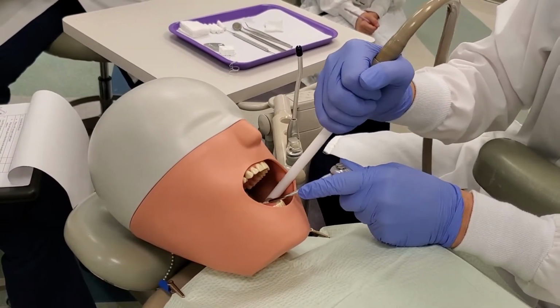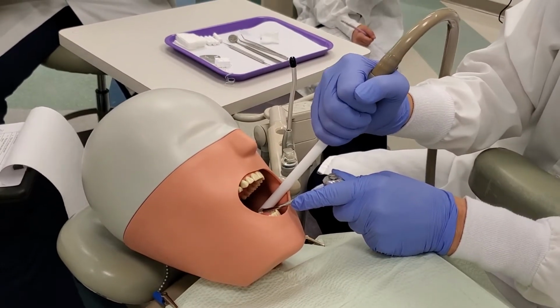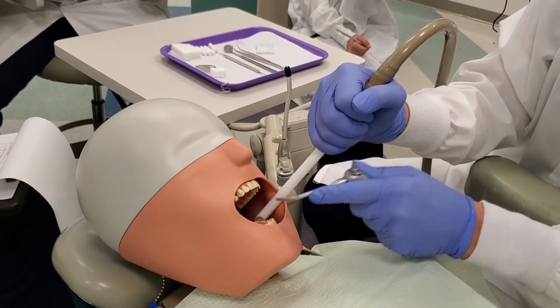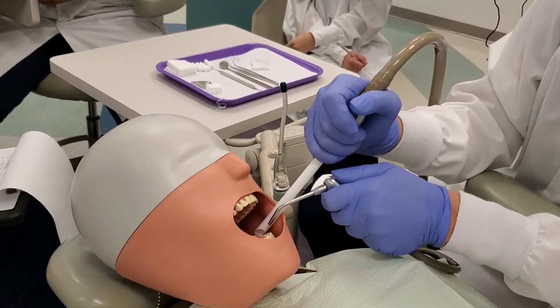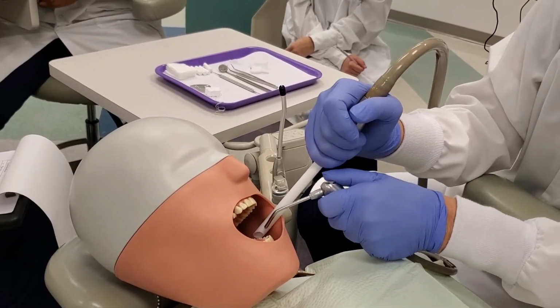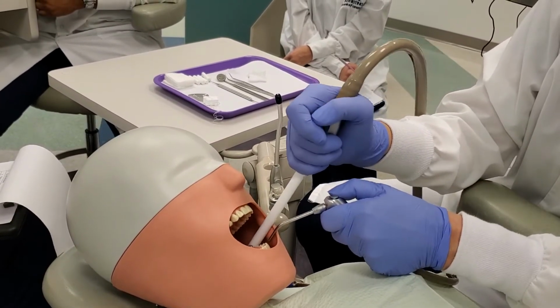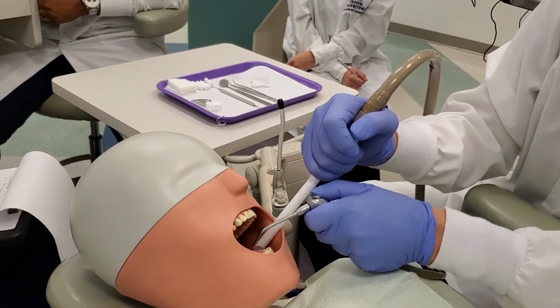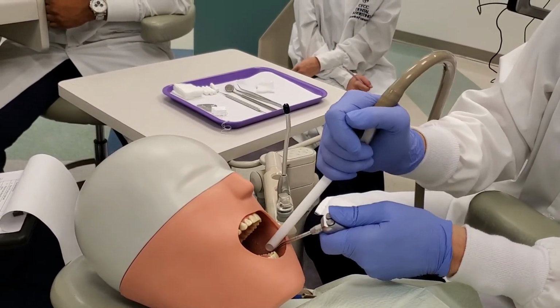Okay, if we're working on 19, you're going to place that on 18. It's going to be parallel to 18, but not touching the tissue. And I'm going to have you go ahead and water for 19, air and water, and then dry it. Okay? All while you're making sure that you're keeping everything nice and dry.